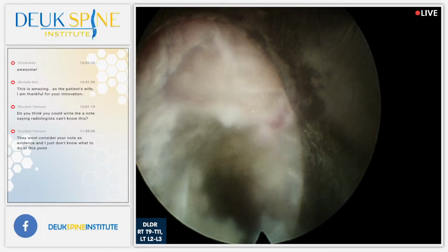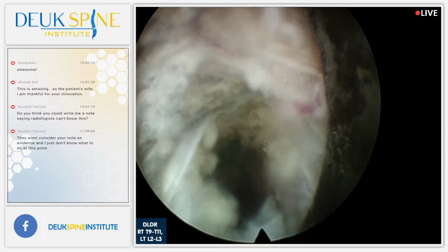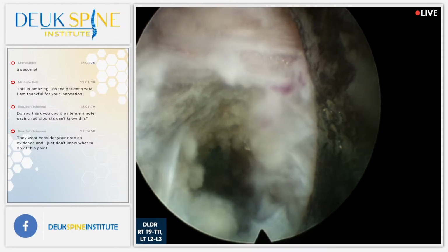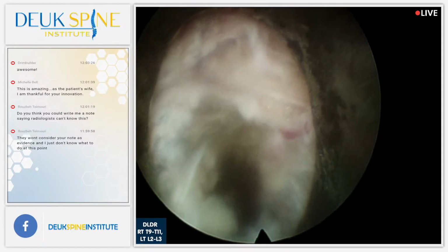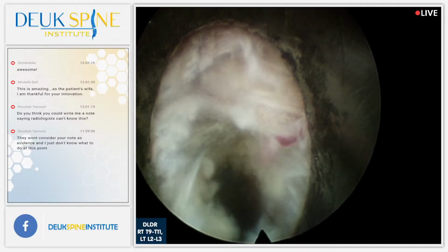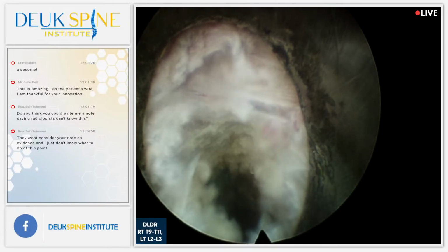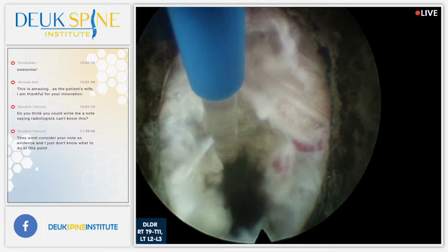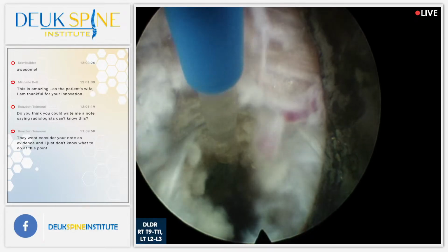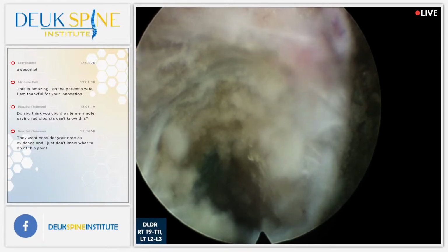What we're seeing here is the back of the disc, and we're outside the disc in the foramen. And I want you to take note. The annular tear that you're seeing there, let me have the laser. Remember, the outside of the tube is 7 millimeters. The inside of the tube is 5.5 millimeters. So that tear now needs to heal, but the good news is by removing the herniations out of it, it made the tear smaller. So that's a 1 millimeter wide fiber. So 1, 2, 3. About 3.5 millimeters is how wide the tear is now.